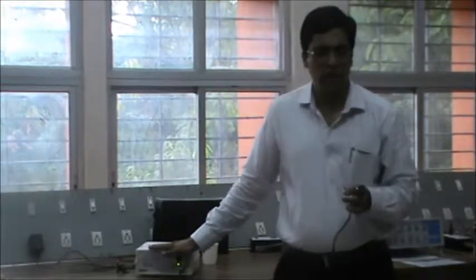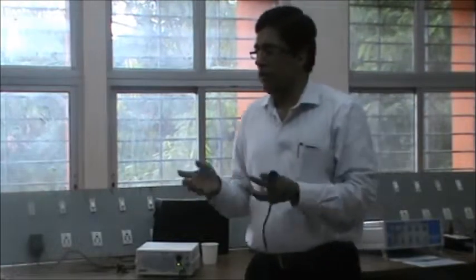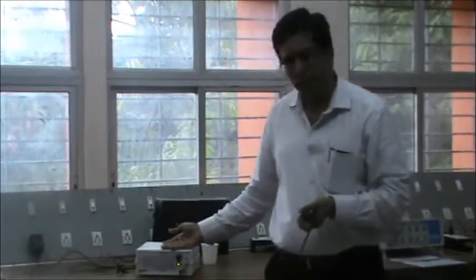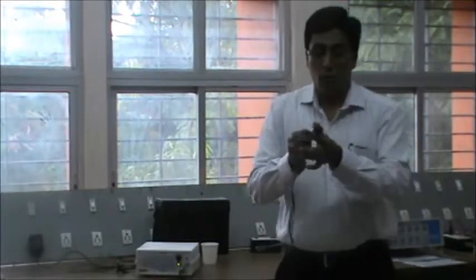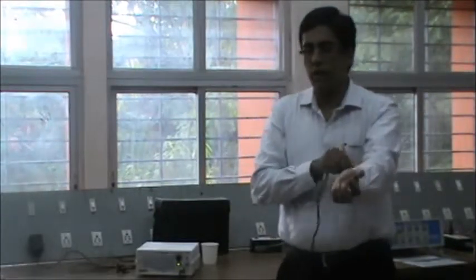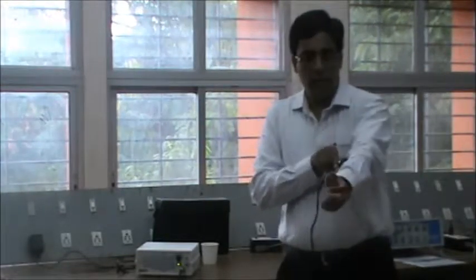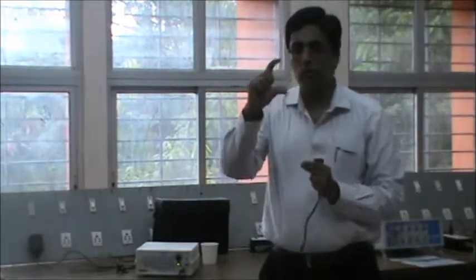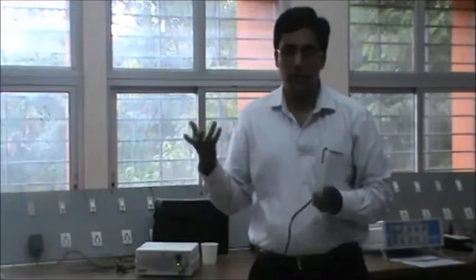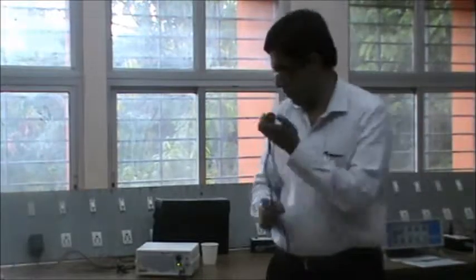So this is the basic ultrasound Doppler, which we can have for 2 megahertz, 5 megahertz, 8 megahertz. You can do any studies basically. With 8 megahertz you could even measure blood flow velocity. At what angle theta? Theta is what determines the angle. You have a particle which is moving, you throw the ultrasound, and then the cos theta determines the response. Then you calculate that reflected frequency using a formula which is readily available. That can give you the velocity of the blood flow.